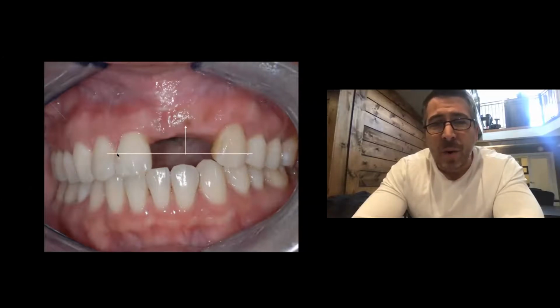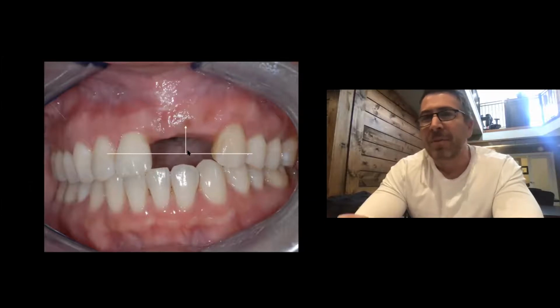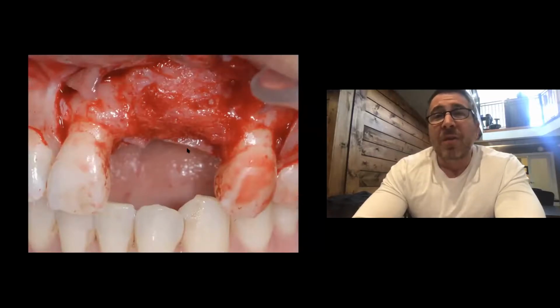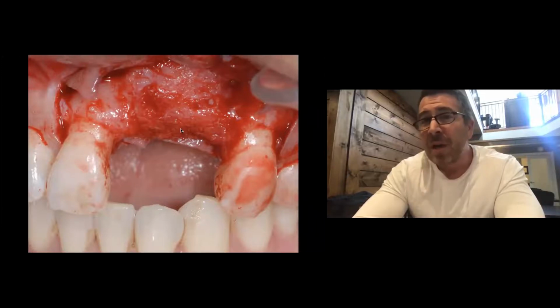But coming again to where we want that papilla to be: if I place 2 implants and I told you implant to implant gives me 3 to 4 millimeters of papilla, am I going to get a papilla in between here? Absolutely not. It's just too far. So you're not going to get a perfect papilla here. And she had to be told that right from the get-go. She was told she will never, in my hands, have a perfect result. So we've got good buccal lingual augmentation of the bone, but again, this area here, I can't make that part come down any further. So if I can't make that part come down any further, what else can I do?